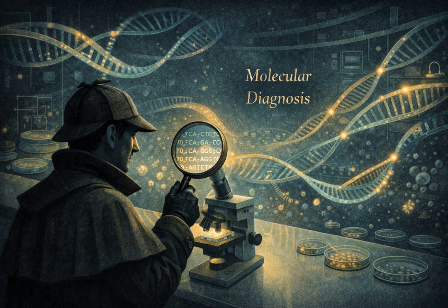And PNA, how does that change things? PNA probes are synthetic. They're man-made. Scientists went in and completely replaced that charged sugar phosphate backbone with a neutral peptide backbone, which is basically a protein backbone. So no negative charge. No charge, no repulsion. Which means the PNA probe binds much, much faster and much tighter to the target DNA than a natural probe ever could. It's like super Velcro. And why does this matter clinically? I mean, why do we need super Velcro?